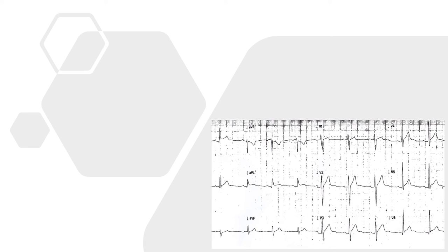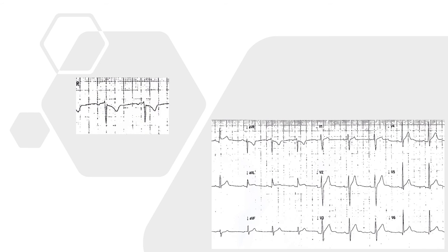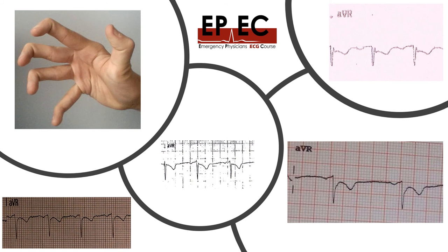And here is another one: diffuse ST elevation, and with a focus on AVR we have the knuckle sign. So when you see an ECG for a patient and you think it might be pericarditis, have a look at AVR and check if you can see what looks like a bent index finger — that will be your knuckle sign.